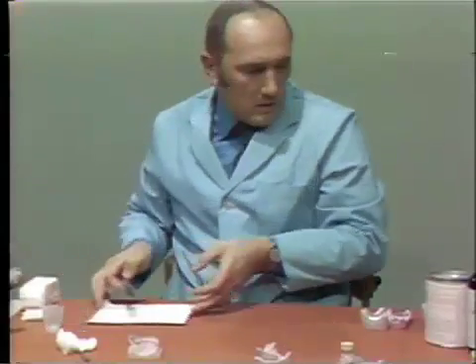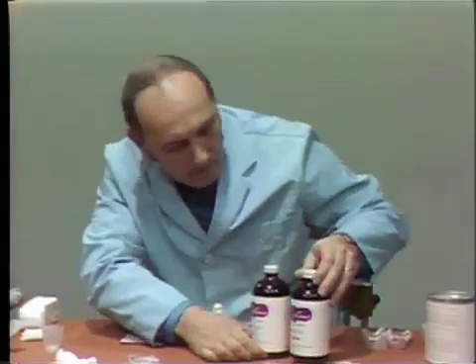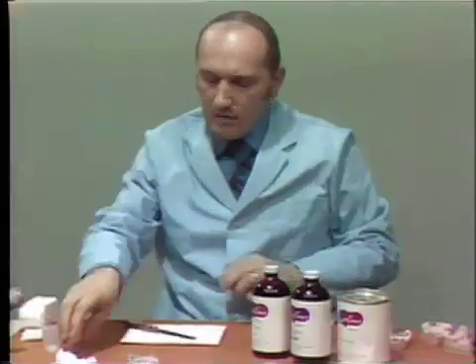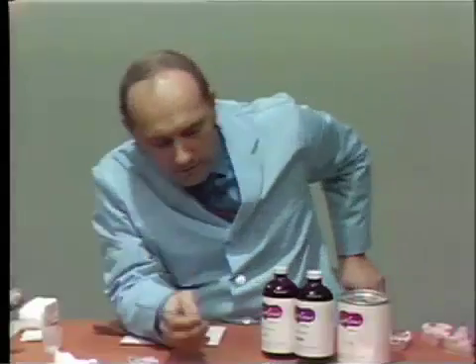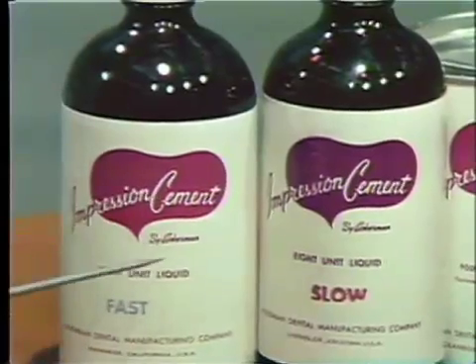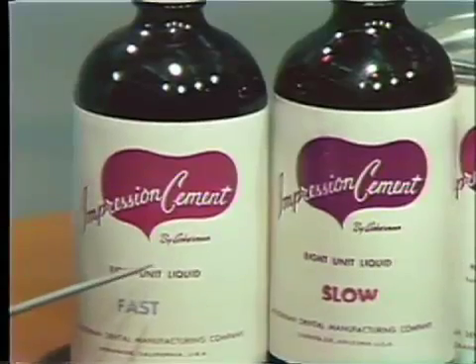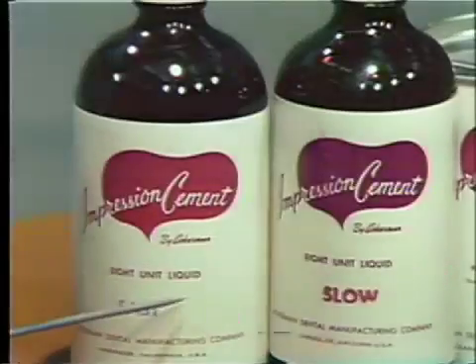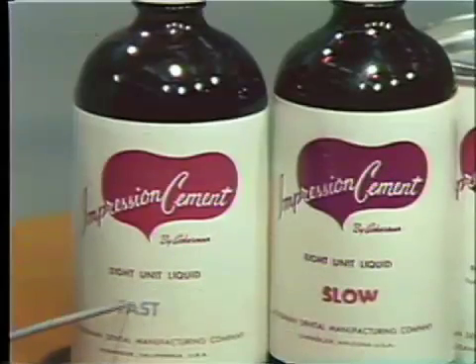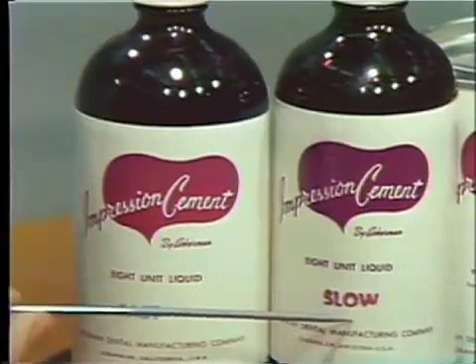Now I'd like to demonstrate the mixing of the impression cement. The impression cement is called Ackermans and there are two liquids that can be used: a fast liquid and a slow setting liquid. If the humidity is under 50 percent, use the fast liquid. If humidity is from 50 to 70 percent, use a 50-50 mix of slow and fast liquids. If the humidity is above 70 percent or it's quite warm, use all slow.